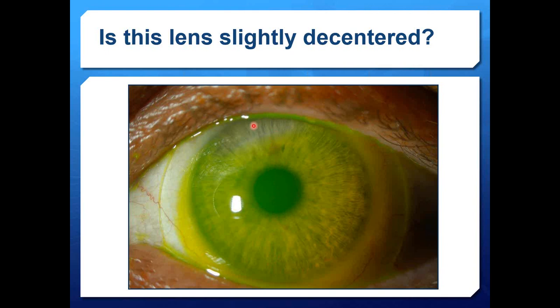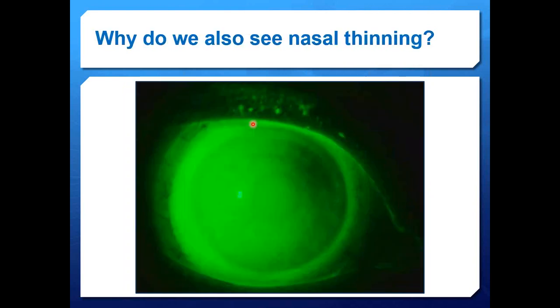So it's very routine to see some thinning or possibly touch in your scleral lens fits. Because you're dealing with a toric sclera, you're dealing with lid force, and you're dealing with gravity. As long as post-removal you don't see any staining here, we don't worry too much about any peripheral corneal thinning of the fluid, but we'll talk a little bit more about that as we move forward.